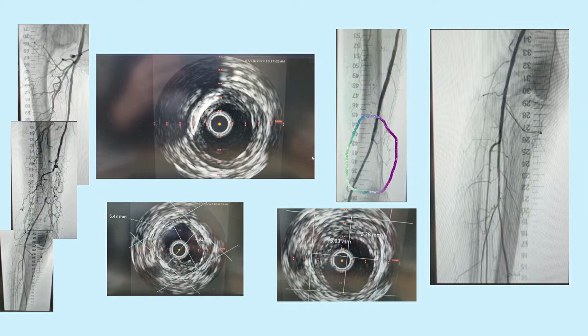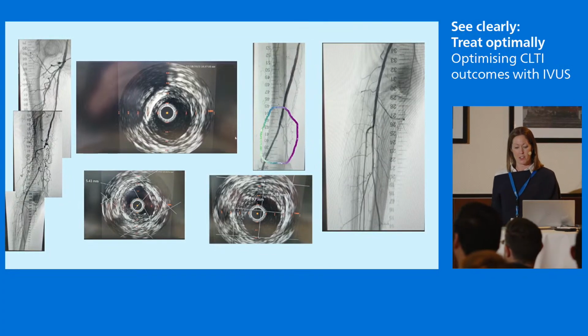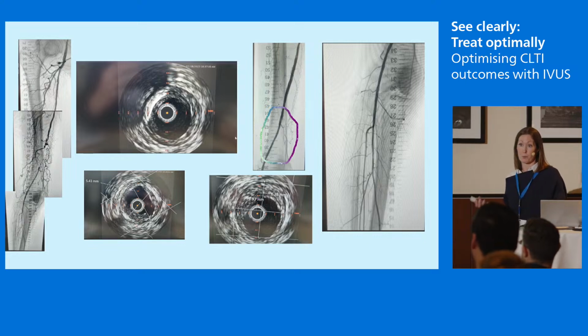I'm definitely at a stage of still hitting the pedal a lot and wanting to itch and do in-between angios a lot, because I know how to interpret it a bit more. But seeing that, I could immediately cross-check it. So I thought that was an interesting phenomenon, and it may well have been that the vessel opened up a bit more just by getting more flow through it.